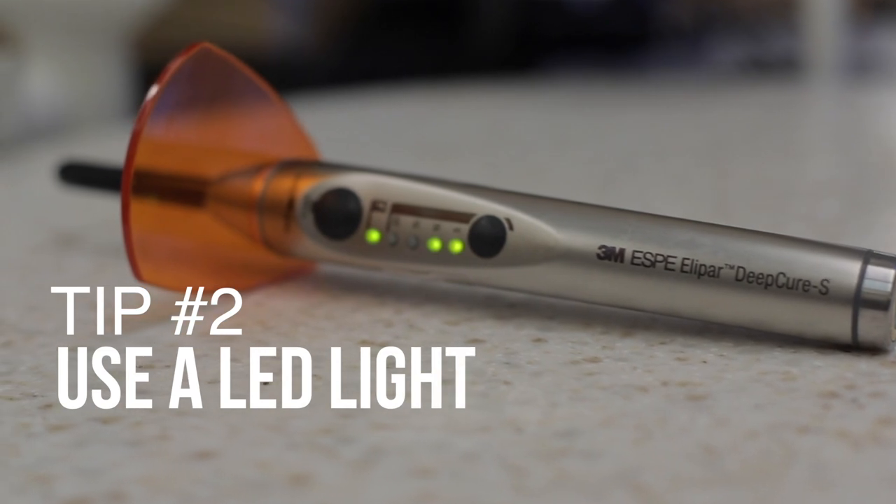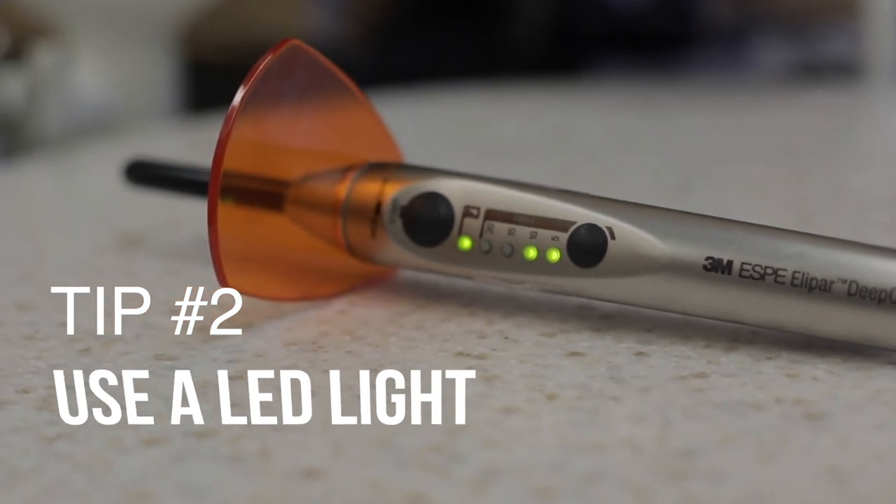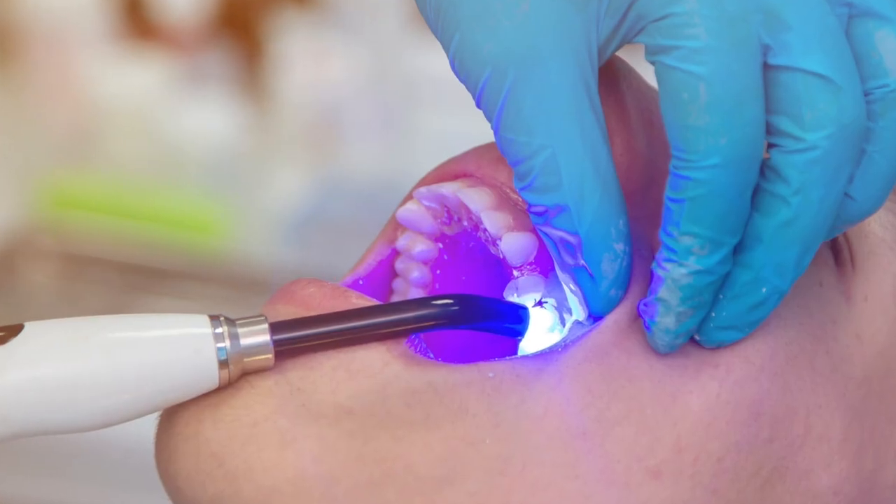Tip number two: use an LED curing light. The technology in curing lights is so much greater than it used to be, and LED curing lights are really the top of the line. They're lightweight, have good battery life, and can be taken from room to room. The latest generations are what's called poly-wave or multi-wave — broad spectrum curing lights that can cure way more photo-initiators than a narrow spectrum light.